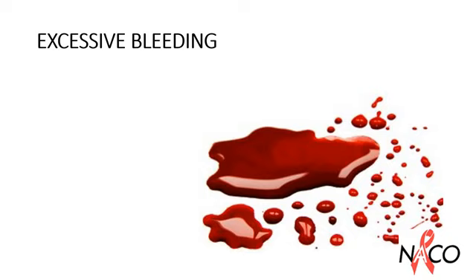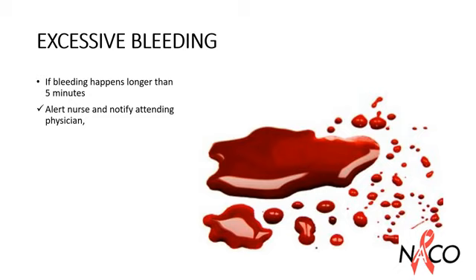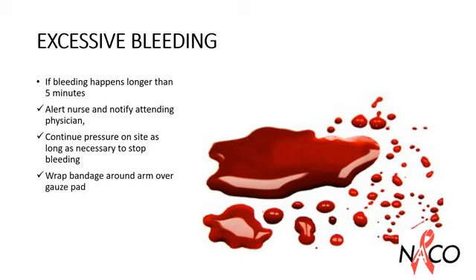If bleeding happens for longer than 5 minutes, alert the nurse and notify attending physician. Continue pressure on site as long as necessary to stop bleeding. Wrap bandage securely around the arm over gauze pad and leave it on the site for at least 15 minutes.